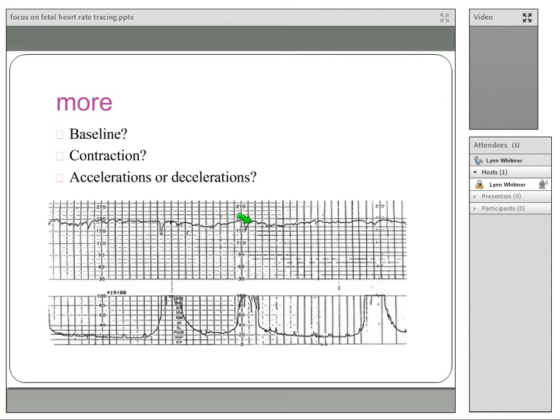So it just so happens that it's happening while she's pushing this baby out. This is a pushing contraction. So I know that the cord is probably around the head somewhere that is causing some pressure on the cord. So this is a cord compression that goes away when the contraction disappears. So she's having variable decelerations, which represent cord compression.